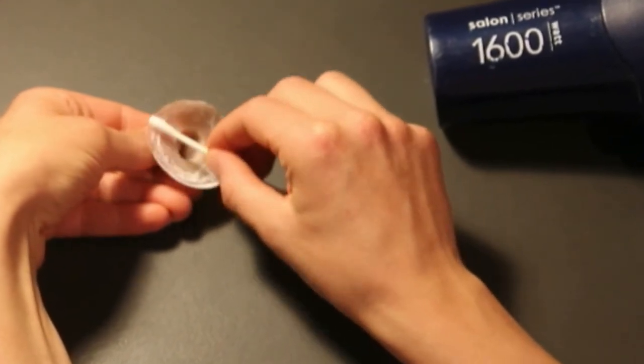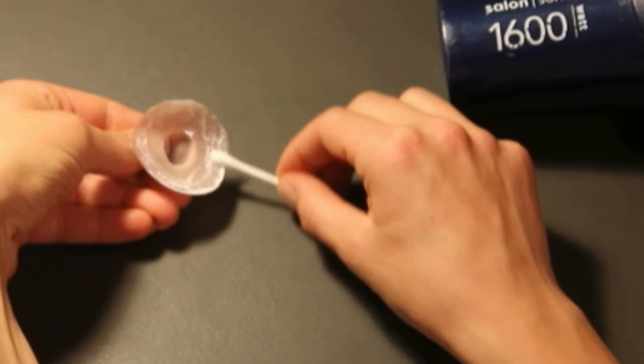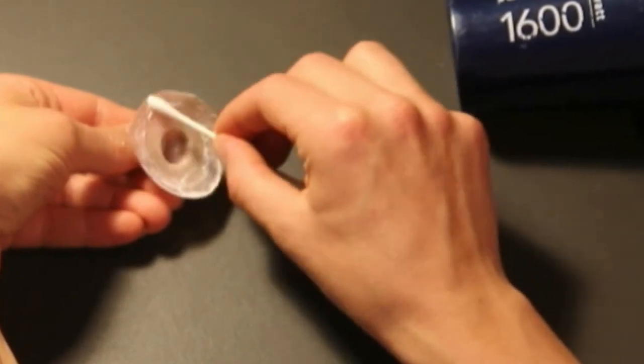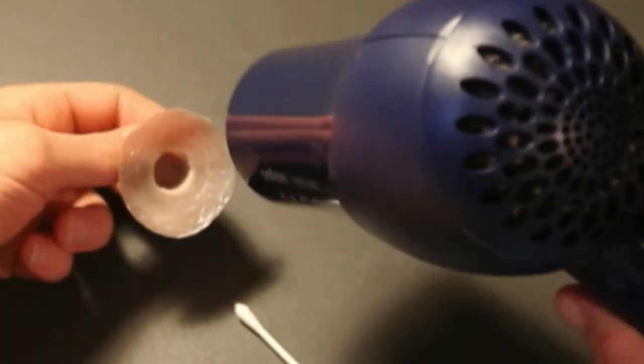The prosthesis is ready to apply when the appearance of the adhesive changes from white to clear. Using a hair dryer will greatly speed this process.